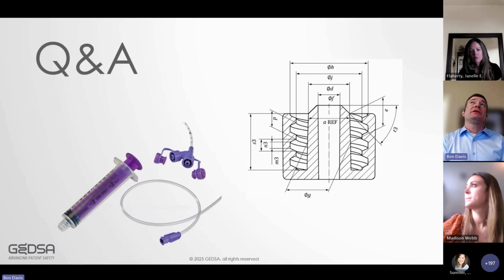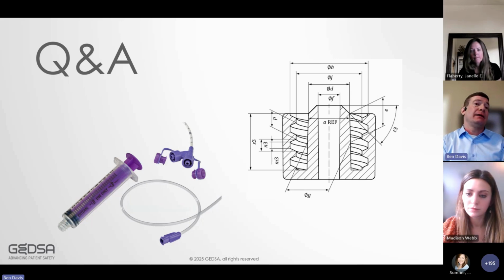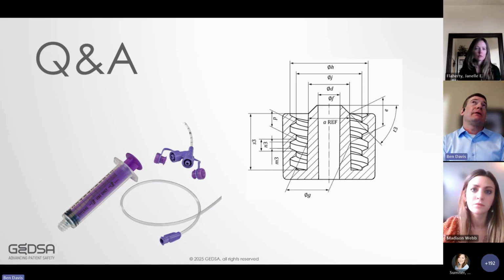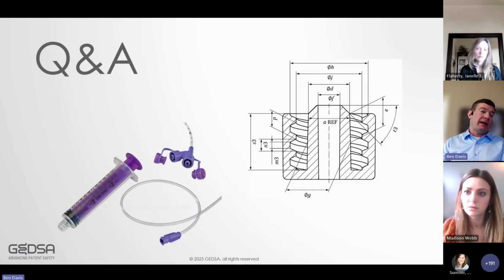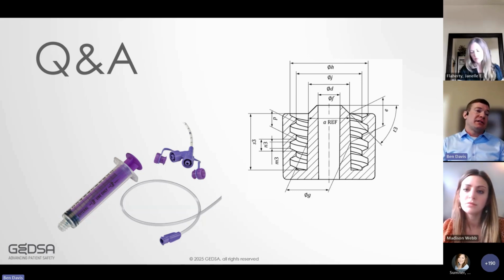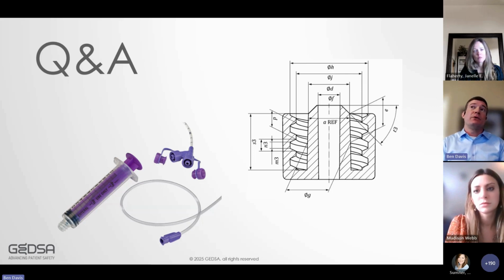So ENFit, in the U.S., we just had our first conversion over last summer, and we're really trying to pick up some momentum, and hopefully this year we'll get a foothold and really start getting some ENFit conversions. There were a few FDA 510(k) device clearances that were needed that have really been the holdup on the ENFit side, but to my knowledge, most of those, if not all of them that represented a real product gap, we now have, and those are now entering the warehouses and getting ramped up so that implementations can begin to occur. So I'm hoping we do start seeing more and more of those.